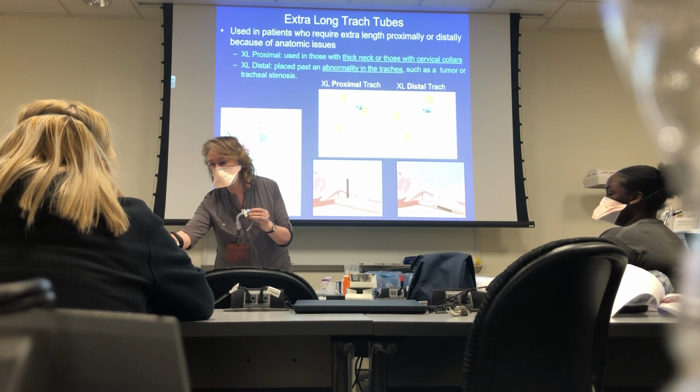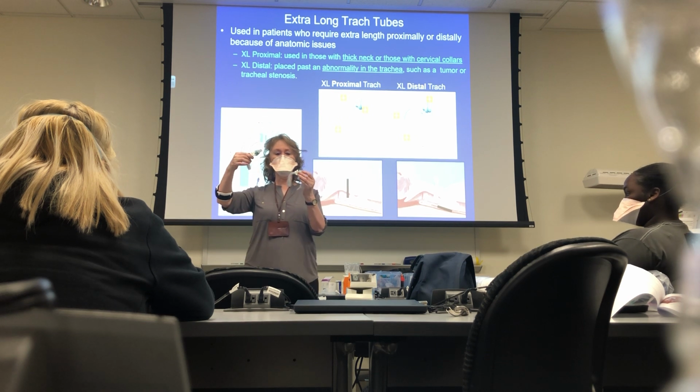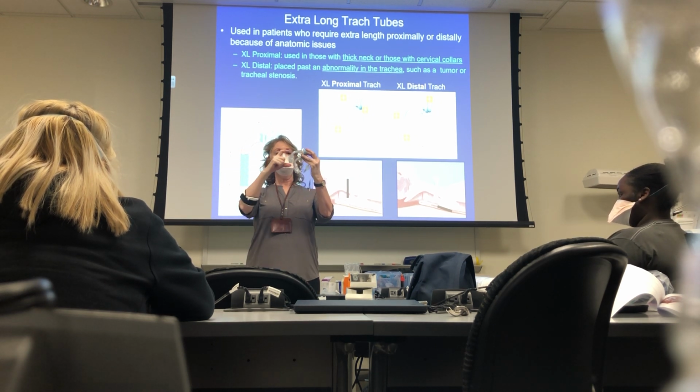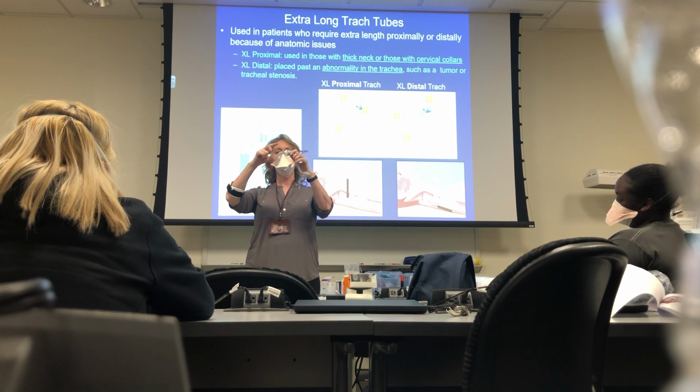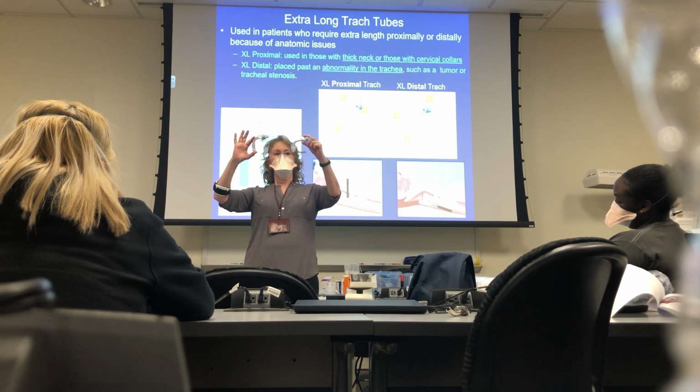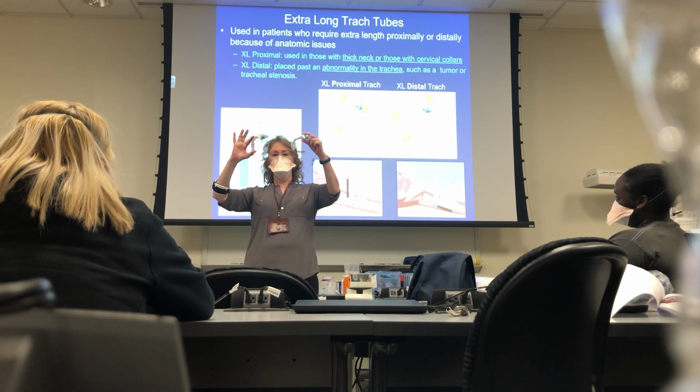Now this one is an extra long proximal. This one is not long from here to here. Look at the difference. This one is longer from here to here. See where the elbow is?